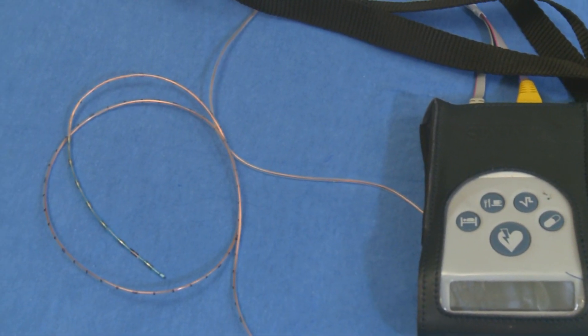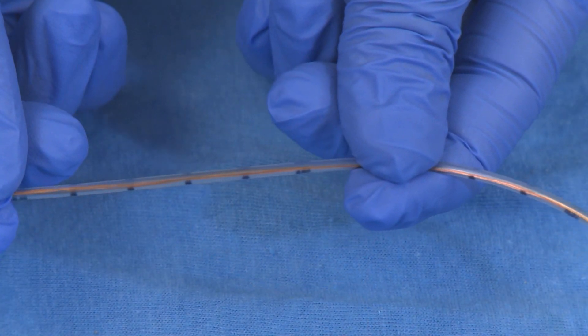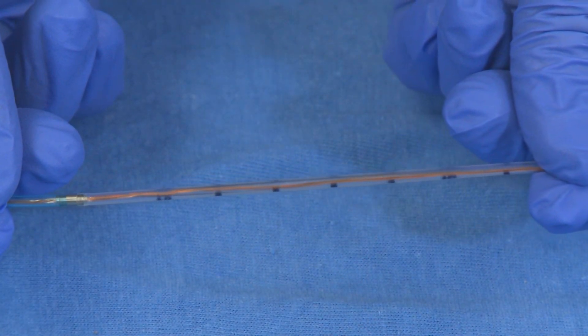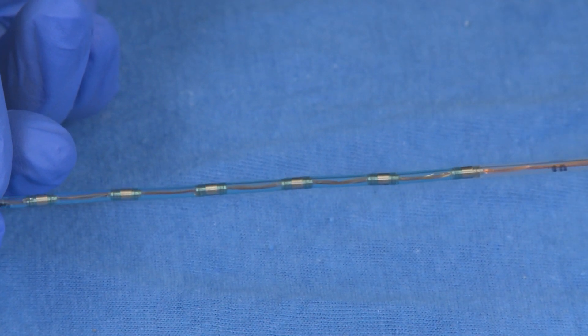Sometimes after we eat or drink, we can feel uncomfortable. Food or liquid that should stay in our stomach comes back up — this is called reflux. An impedance pH probe measures acid and non-acid reflux in your child's esophagus or food pipe. Sensors along the probe allow us to measure reflux at the bottom, midway up, and at the top of the esophagus. Your physician may have ordered an impedance pH study to see if your child's medications are working to block acid, or to see if your child has acid, food, or liquid coming from the stomach back up into the esophagus.